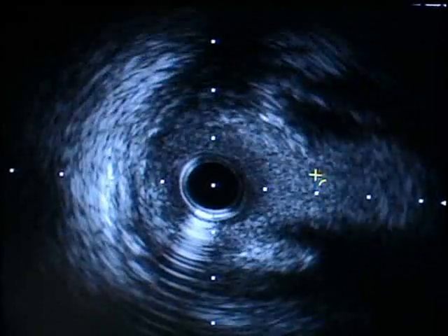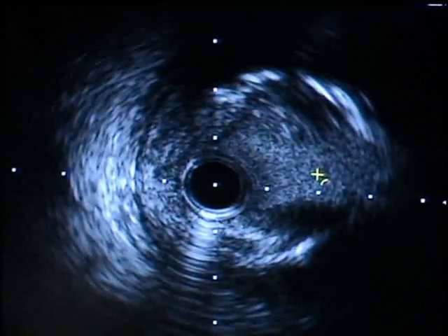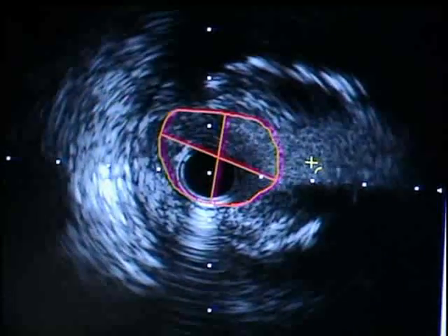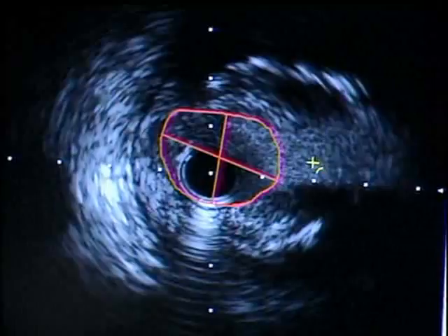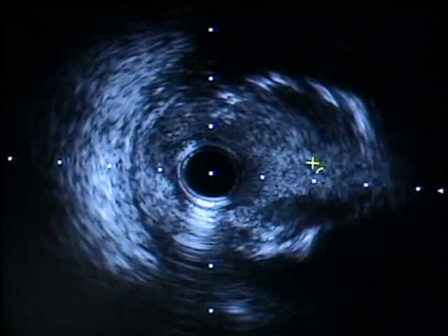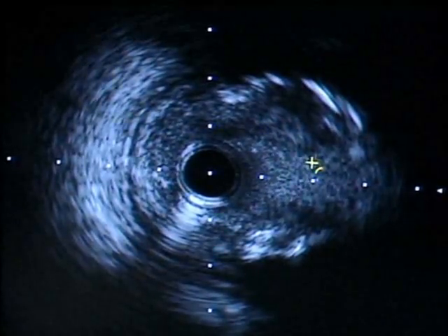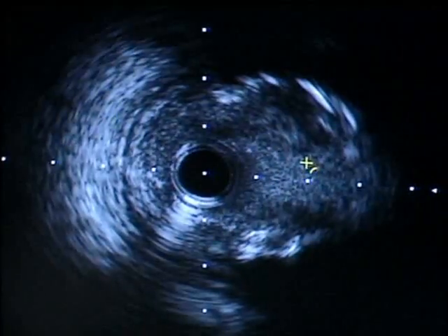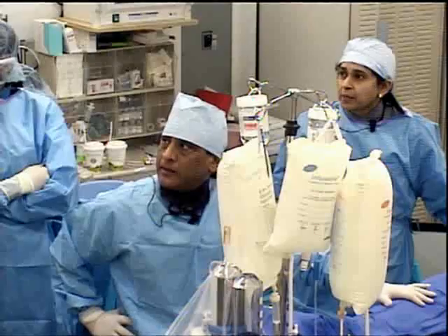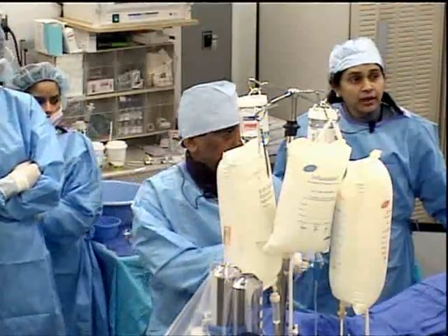This is, I would say, the ostial circ coming into the distal left main. You see eccentric plaque, but truly not very obstructive. Go to the LAD. And that's the measurement: you start seeing a little bit of the left main there, and at that area right there, I was getting like 4.4, 4.5. Okay, let's go to the LAD now. Not much of a calcification there. Okay, now this is the LAD.